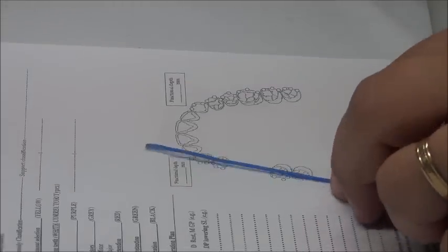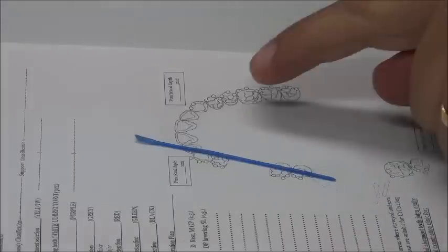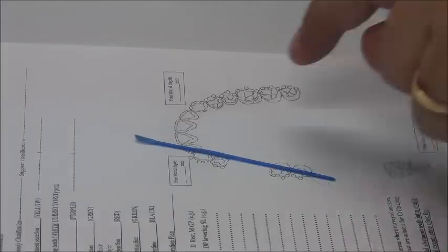Do I need to add components here? Why? We have two reasons to add, either because of indirect retention or because of cross-arch stabilization. What do I need here? I need both. I need indirect retention because this is my principal fulcrum line between these two rests, so I have to extend somewhere here.